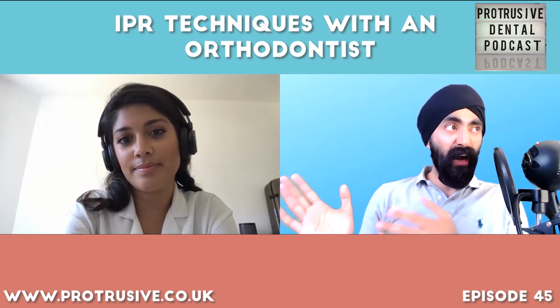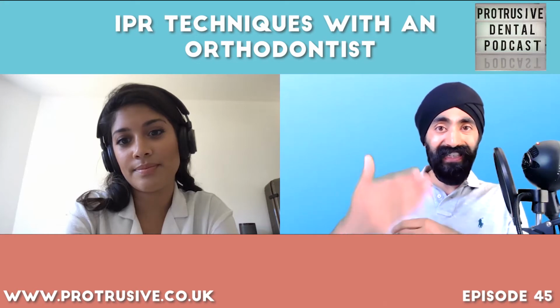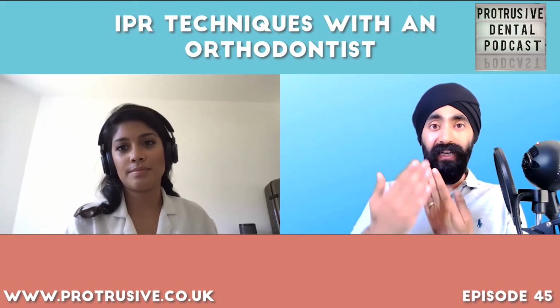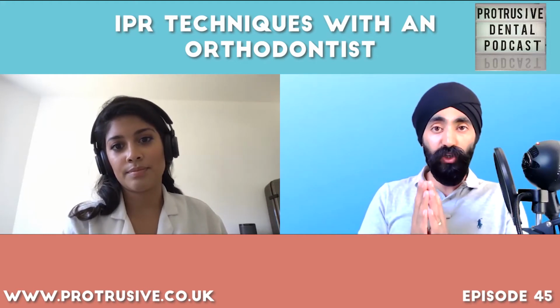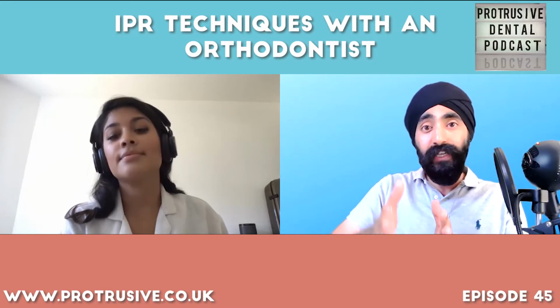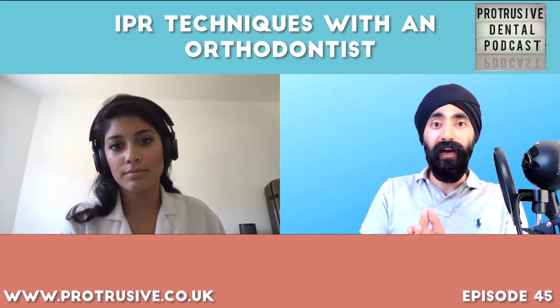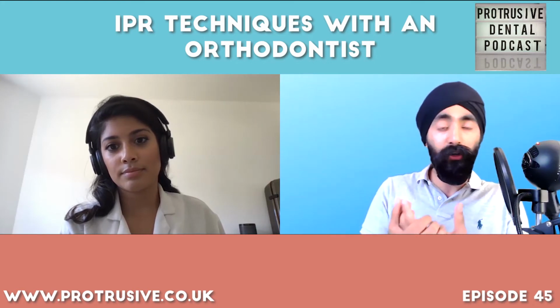And a term that I actually learned from Tiff Fresh some years ago is PPR. So it's predictive proximal reduction, where you're doing it in advance, so that as the teeth move into the correct, aligned position, you've already accounted for that. So it's a great thing to plan in advance, so that you can actually remove the amount of enamel that you need to get a more rectangular appearance, and therefore get rid of a black triangle.